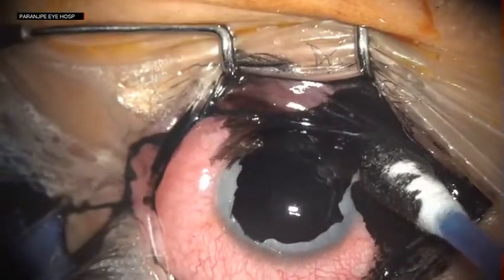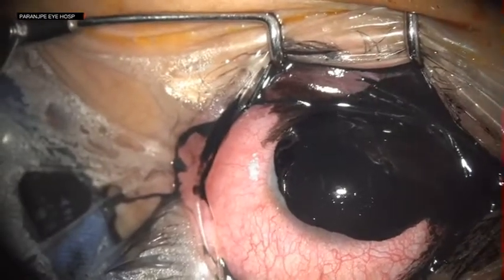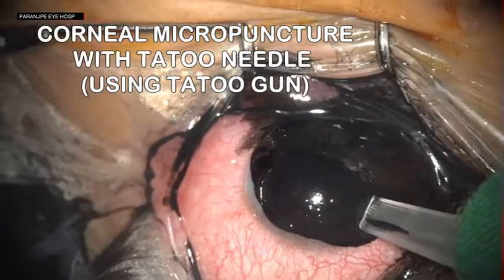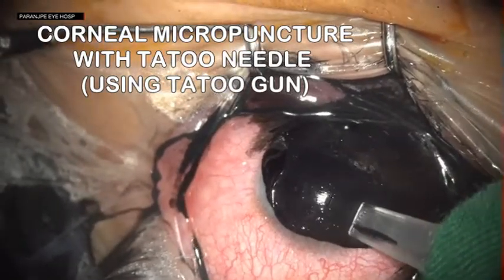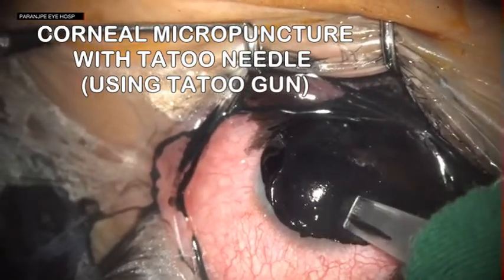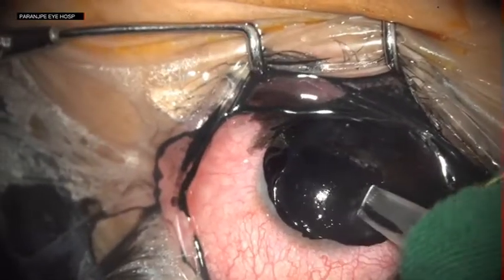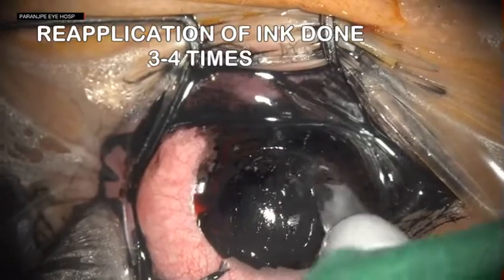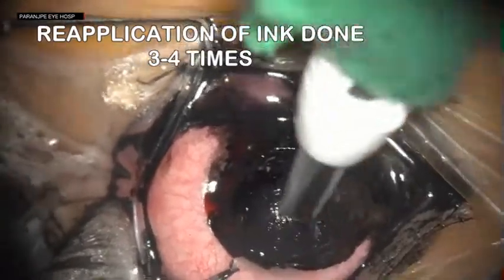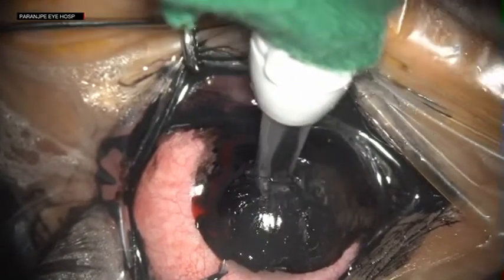Using a tattoo gun, micropunctures are made in the cornea so that the pigment penetrates the cornea. One must be careful while using this needle and should go from the periphery to the center.